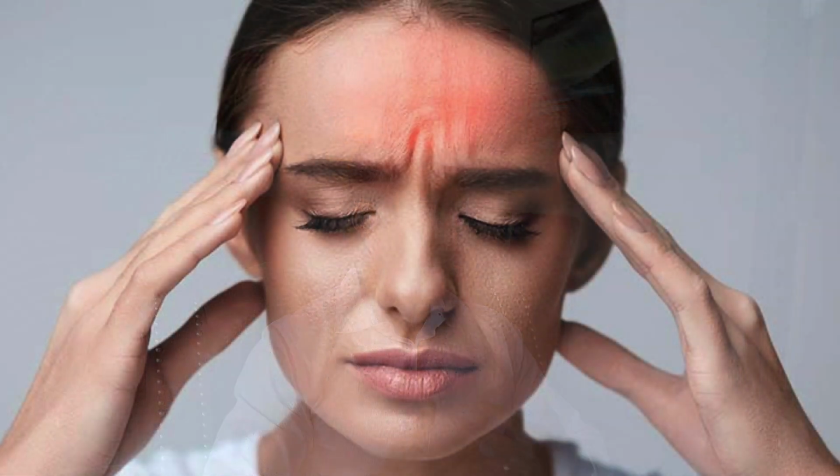For example, pressure changes. So if there's increased pressure in the head, then it will show up sometimes affecting the optic nerve that we see on the fundoscopy. So if somebody comes in for headache, as an example, a lot of times we can get a sense if the patient has increased intracranial pressure.